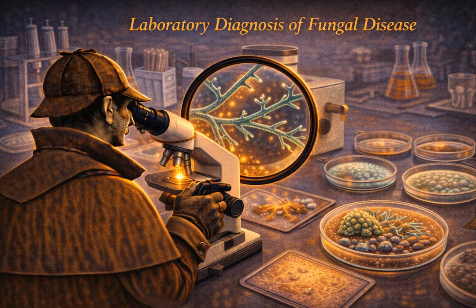That is such a critical point for everyone listening. BDG is blind to mucor and crypto. You have to deeply understand the limitations of your diagnostic tools. Absolutely. A test is only as good as the clinician interpreting it.